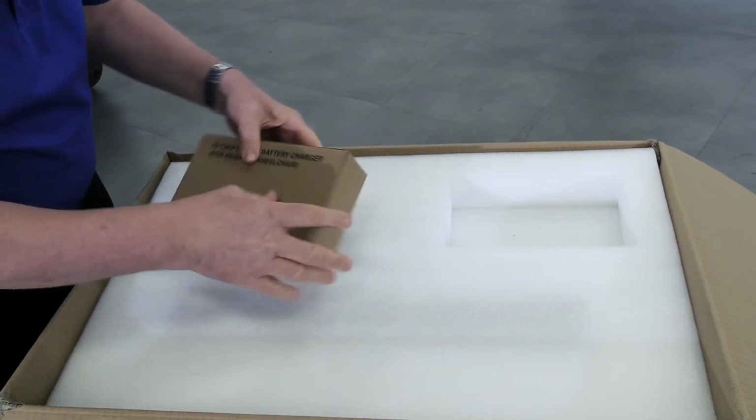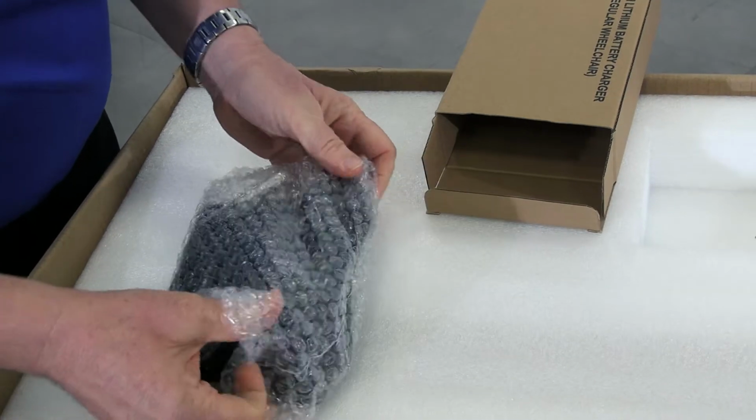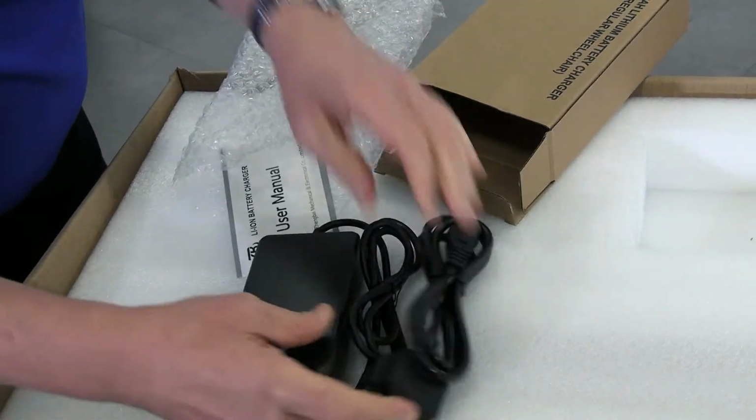Packaged inside a small cardboard box, you'll find the battery charger. Set this to one side as you will need this when the chair is assembled and ready for use.